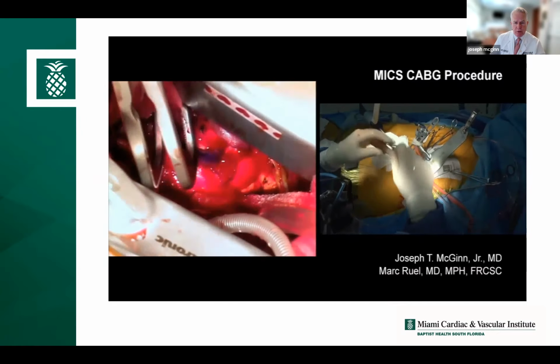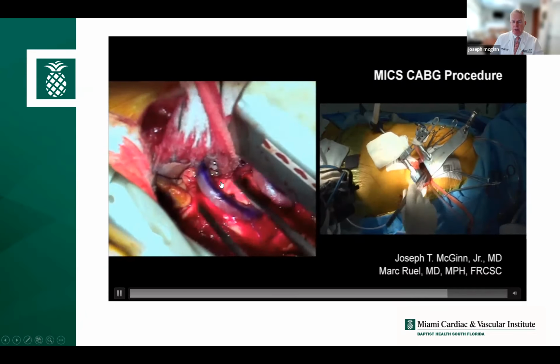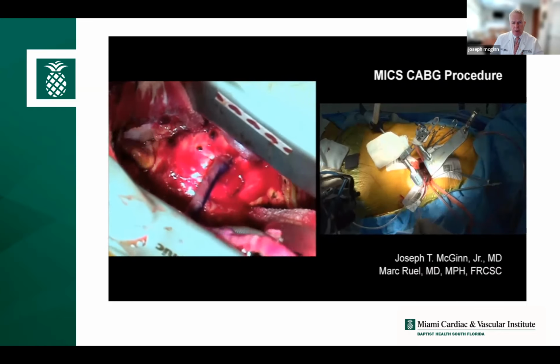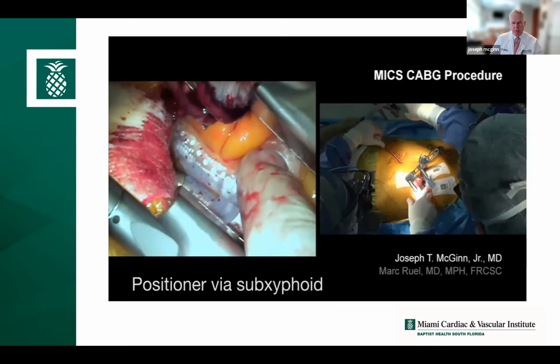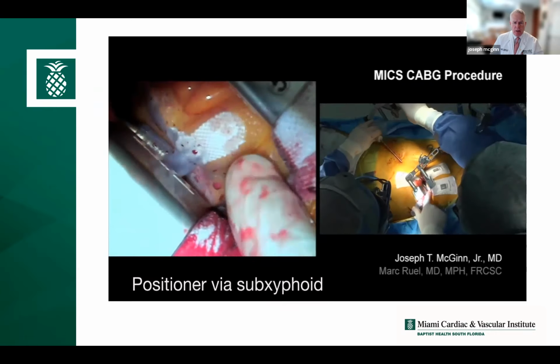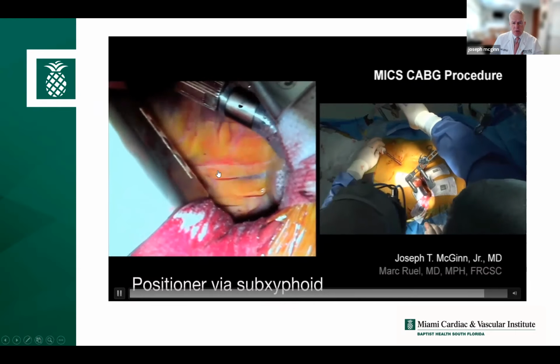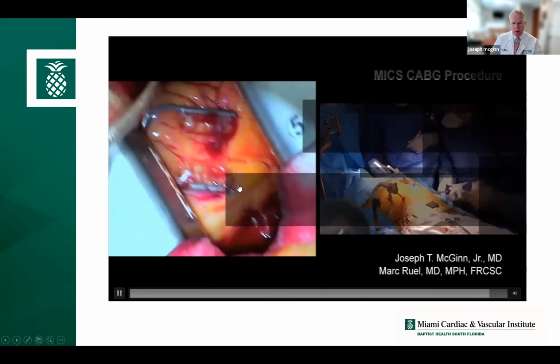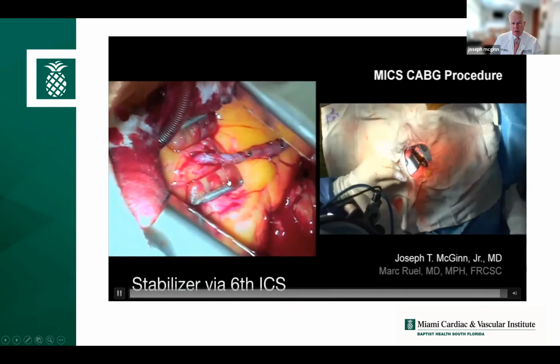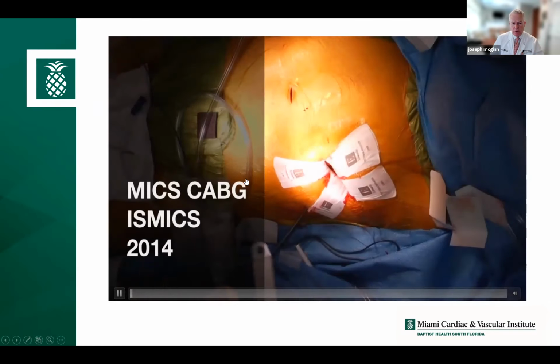So you can see two grafts are attached to the top of the aorta in this particular scenario. I think this patient ended up getting a triple bypass or a quadruple bypass. I can't recall exactly. But you can see the bypasses are connected to the aorta, so they already have blood flowing. This is what we call a positioner. This is a device that sucks onto the end of the heart, and then you'll see we move the heart around so we get to the vessel we want. This is a right coronary artery bypass, so we're going to go right to that artery right there. This is the positioning for an LAD, which is one of the big vessels on the front of the heart, and that's the bypass right there, and we're completing it and giving new circulation to the patient.